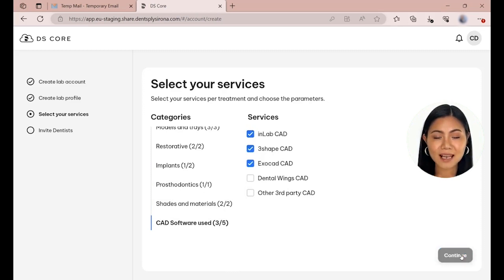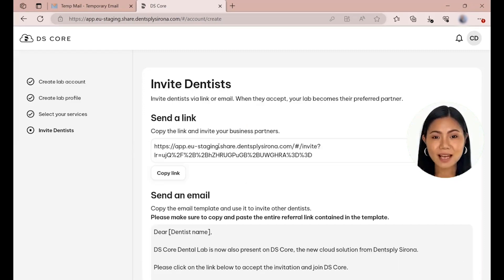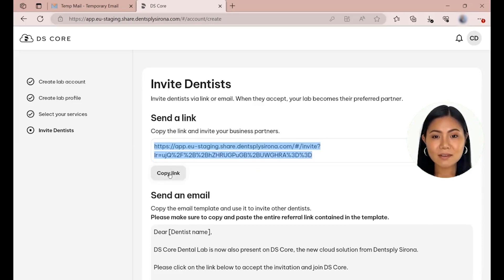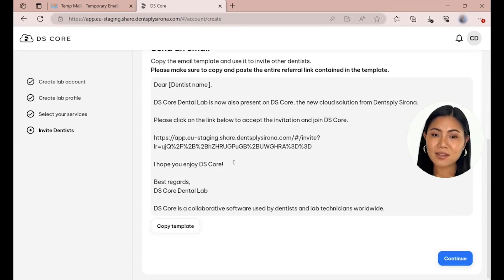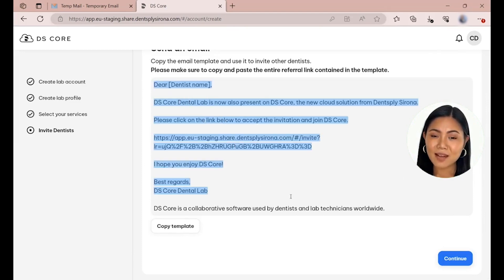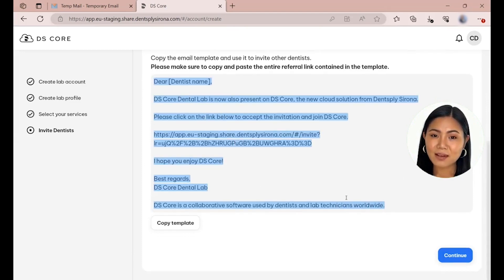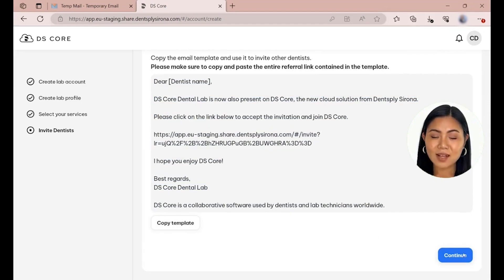Click on Continue to get to the last step. In the last step, you can invite your partner practices and let them know that you are now on DSCore. We provide an invitation template, including a sign-up link for dentists that can be used to send out an email from your email account. When a customer creates an account using the link, the lab automatically becomes their preferred lab. This template can also be found at a later stage under Laboratory Configuration.